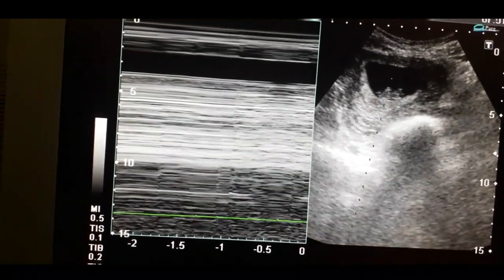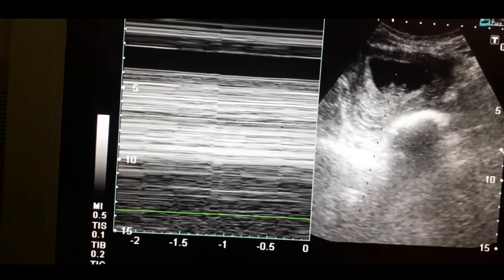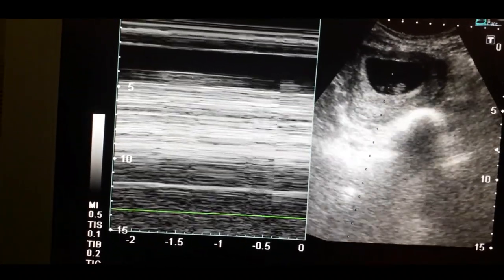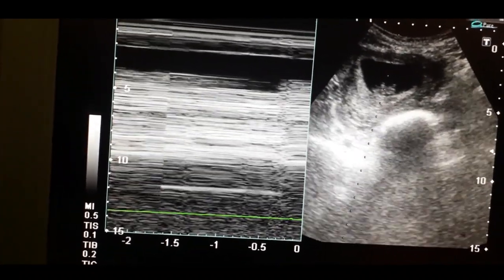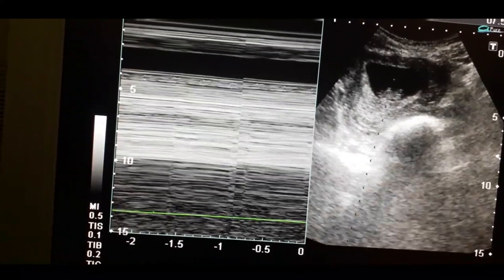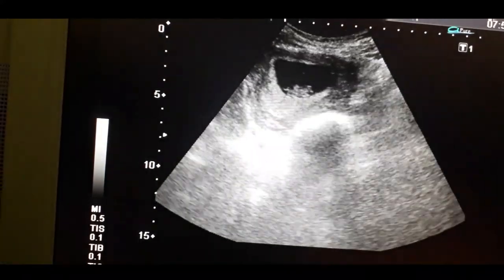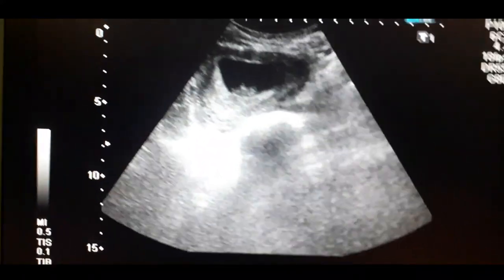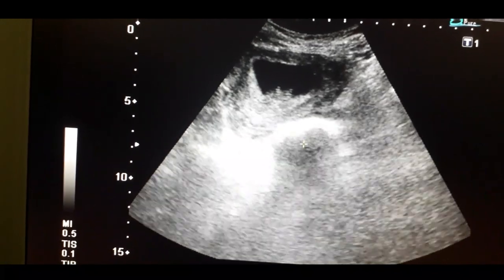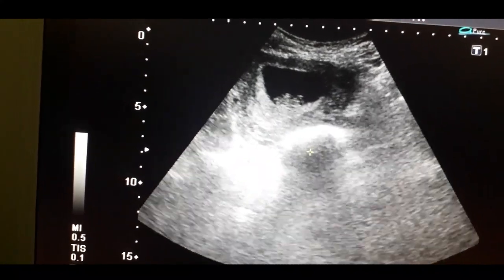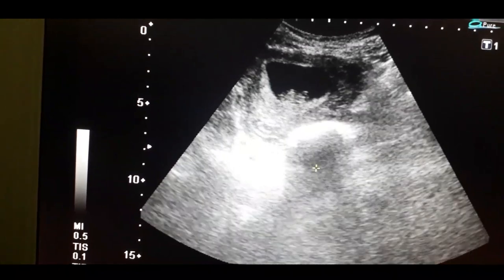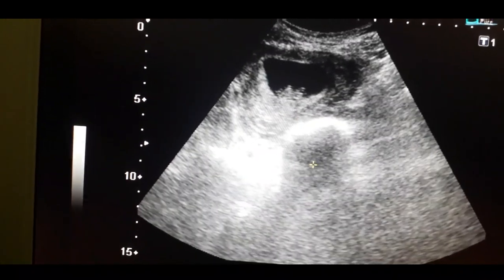This is the dating scan and FCA is positive. You can see the fetal pole very clearly within the gestational sac.